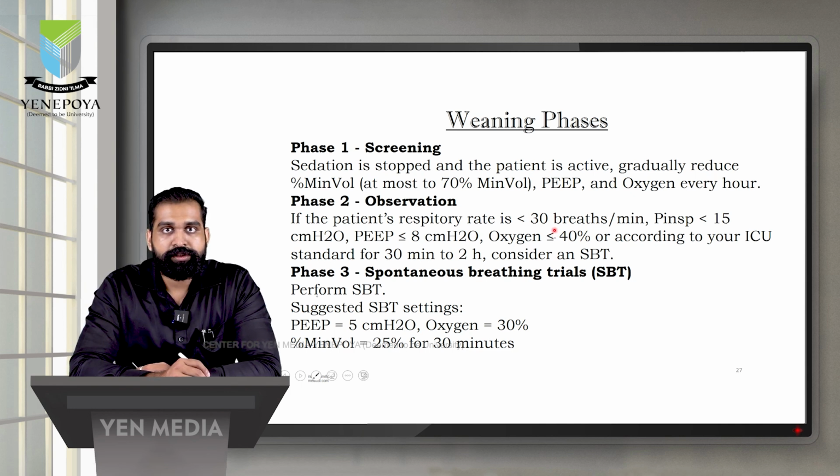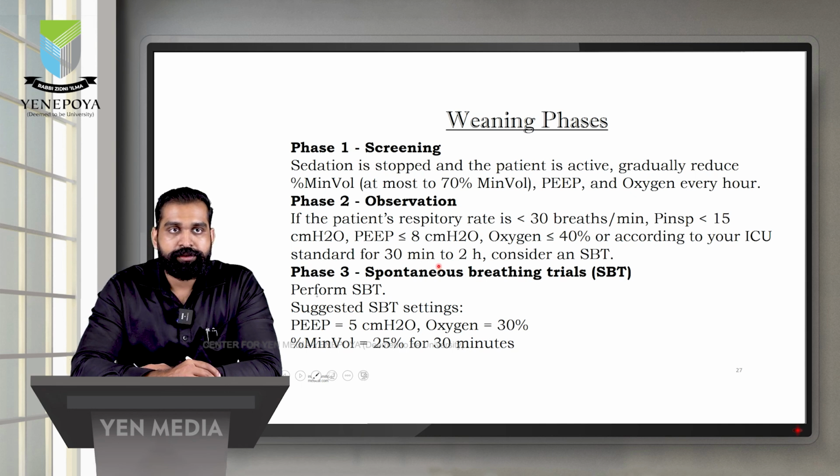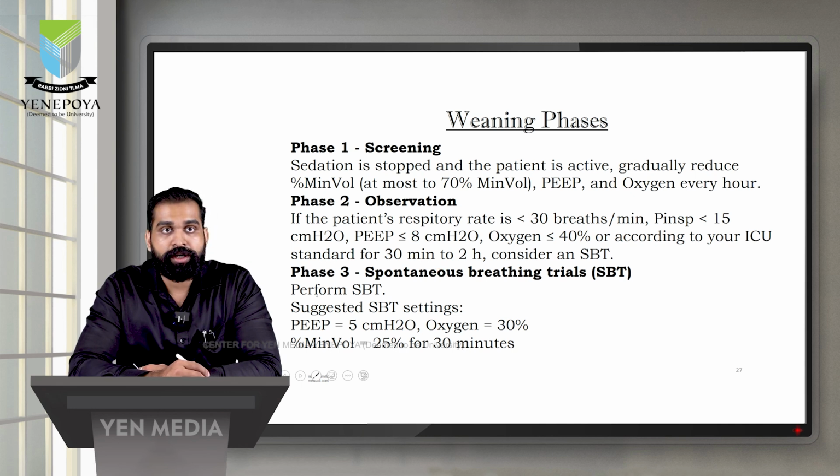Now, if the patient can maintain on these variables and values for about 30 minutes to 2 hours, you can consider switching the patient to a spontaneous breathing trial. Now, during the spontaneous breathing trial, you're going to have the following settings.